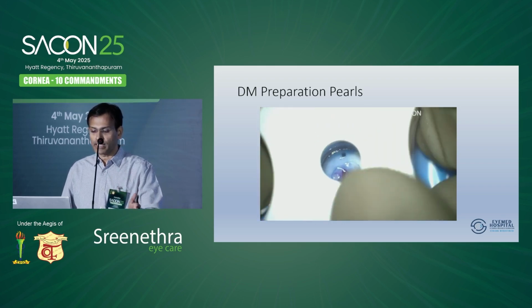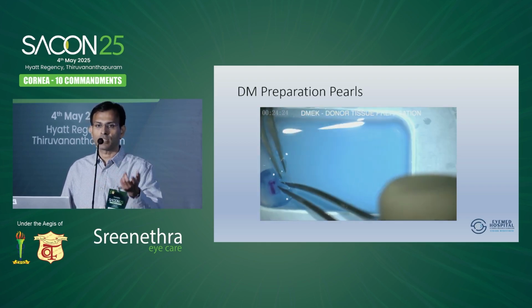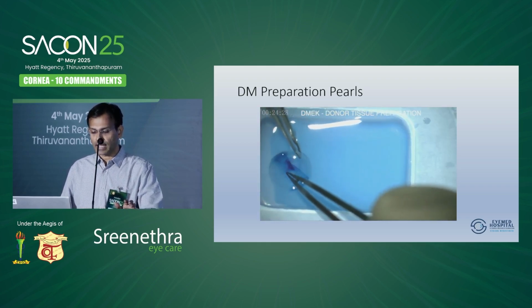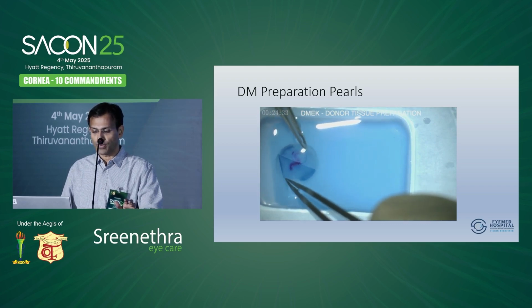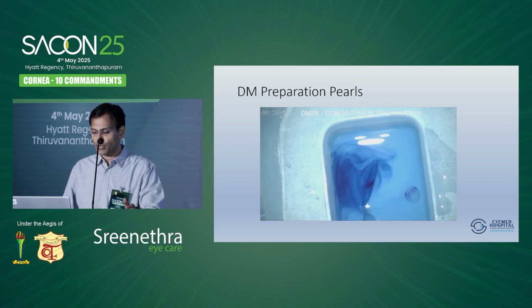And sometimes in COVID times, I will not go full thickness. I'll just mark it, and the other portion I use for DALK. So this again in water bath you can remove. So even the central 3 mm hole I do not make. I just mark it directly on the endothelium, and then you can take it in the injector.